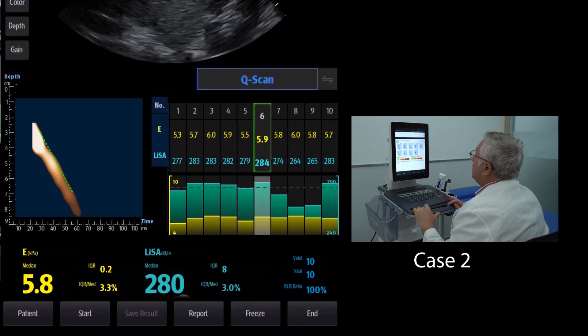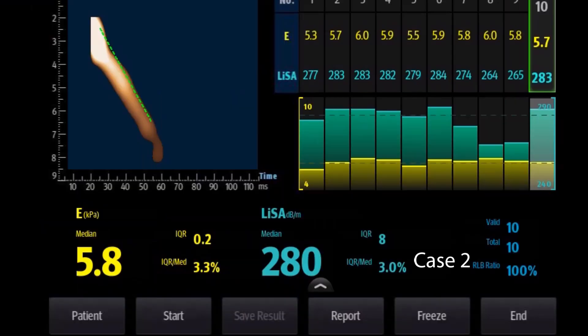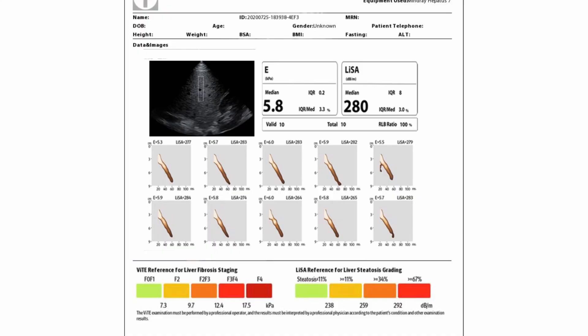Case number two: this patient has a fatty liver. The median E-value is 5.8 kilopascals, whereas the LISA median value is 280 decibels per meter. Both values are reliable because the IQR divided by the median E is less than 30%, and the IQR value for the LISA measurement is less than 40. Therefore, we can conclude that this patient has no risk of fibrosis, but has a moderate fatty liver, according to the stiffness, steatosis, and histopathology table.